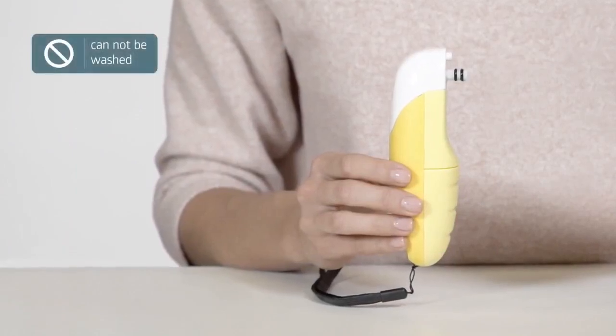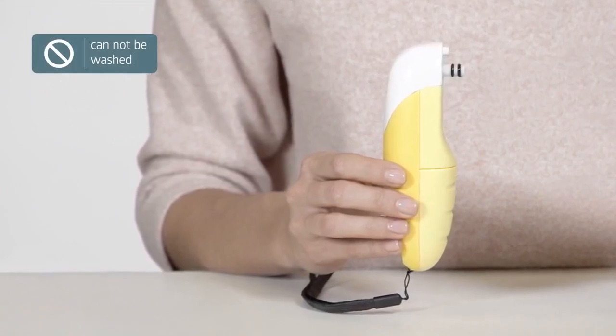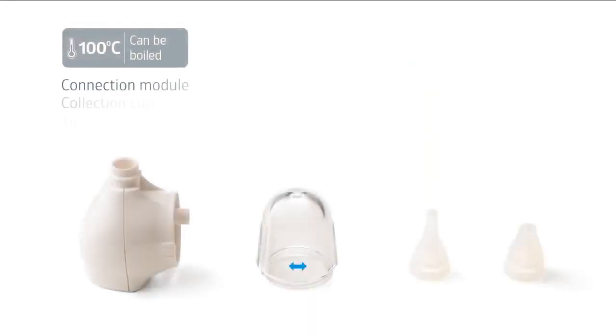The main part of the aspirator must not be washed with water or immersed in liquid. The connecting module, collection cup, and tip can be boiled. Do not boil longer than 3 minutes.